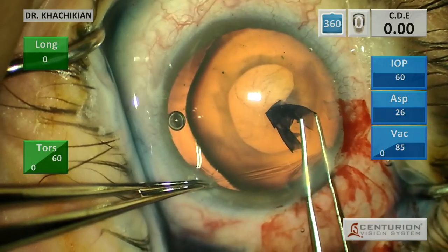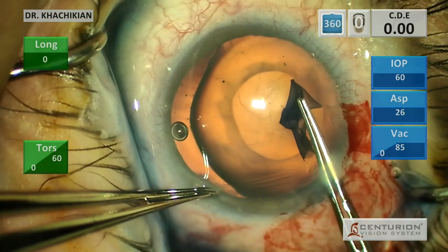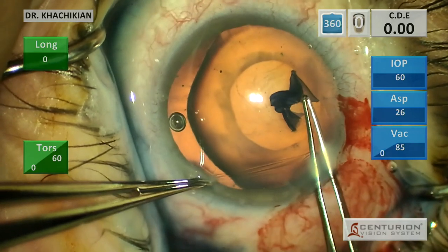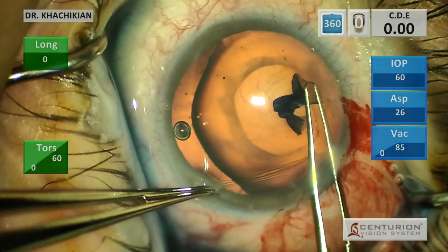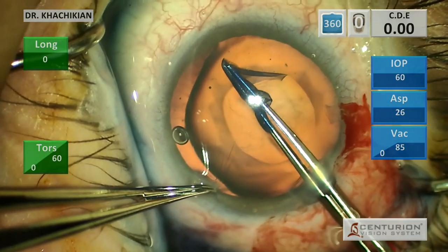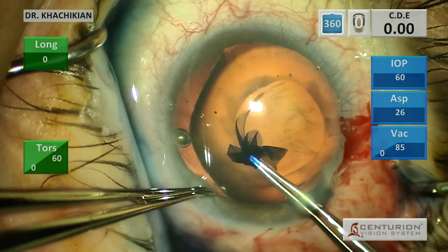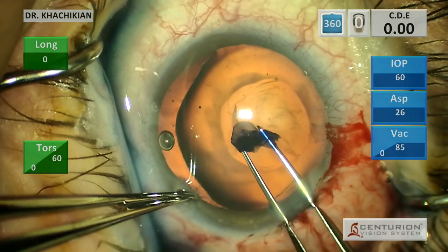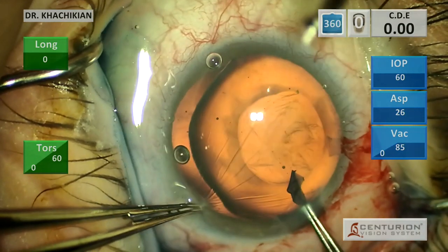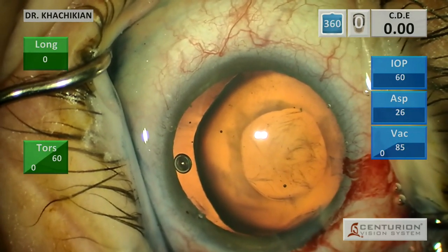If you've used capsular hooks before, you know they have kind of a duckbill shape to them and they will situate themselves in the capsular fornix, which is nice. That is the advantage of them over just using iris hooks to stabilize the capsule. The utility of the capsular hooks is that you are able to get the hook portion all the way into the capsular fornix, so you want to have a good anterior capsule for that.